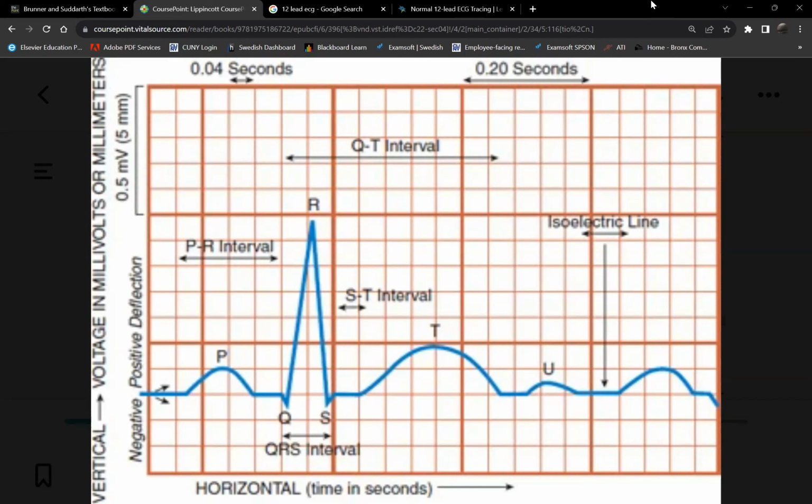And this one, like right now, the patient needs to go to the cath lab because otherwise the patient will die unless we restore blood flow to the rest. All right. So that's the significance of the ST segment. It indicates myocardial ischemia.